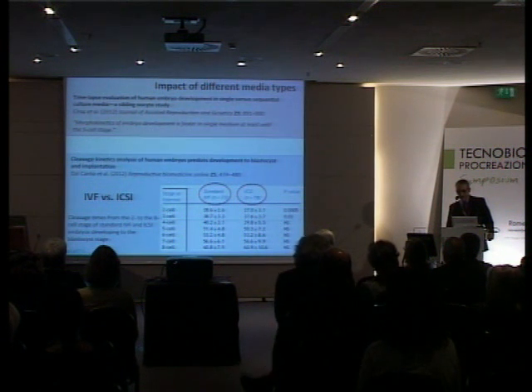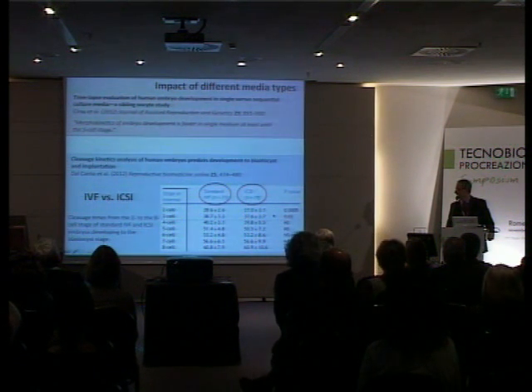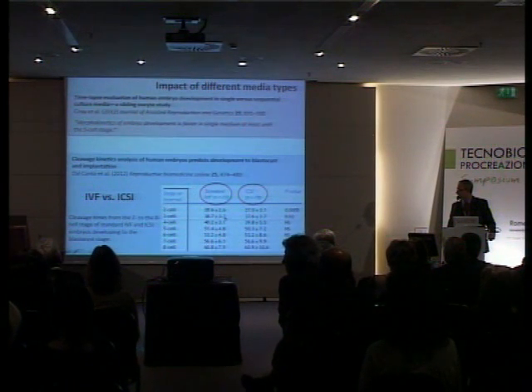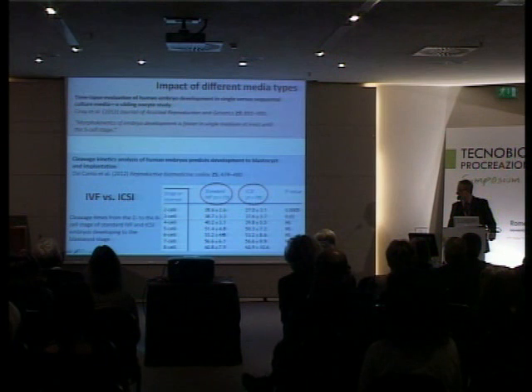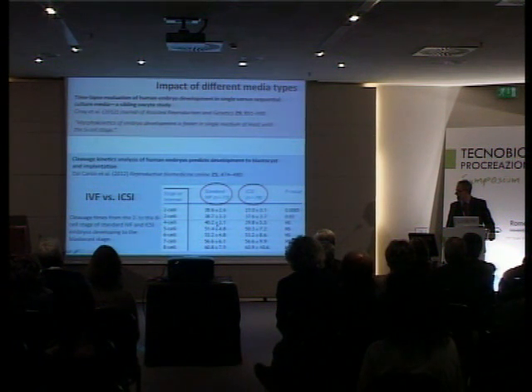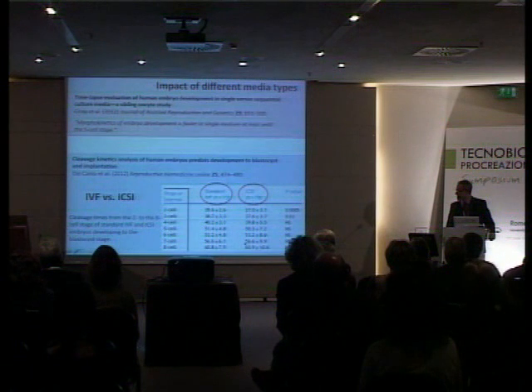And what you can see here, in fact, initially we have a delay, the 2-cell stage or 3-cell stage times, but this delay is totally eliminated over the following cleavages. And in fact, the similarity is very striking.